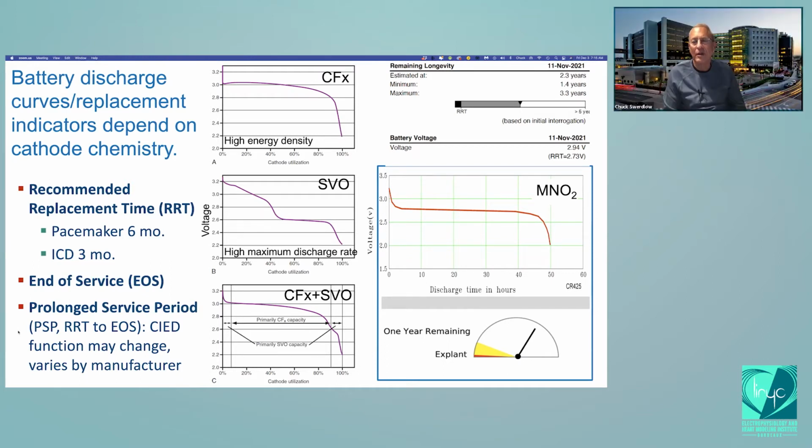In defibrillators, there is an estimated power drain based on the current level of pacing. So let's say, for example, pacing is typical, a dual chamber defibrillator might be 20% in the atrium and 1% in the ventricle, and some nominal amount of shocks.